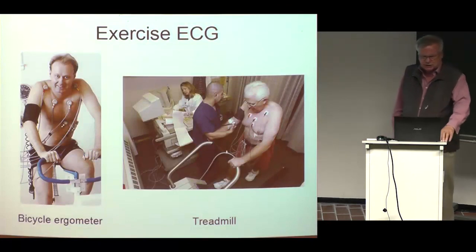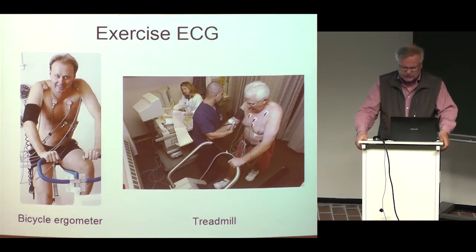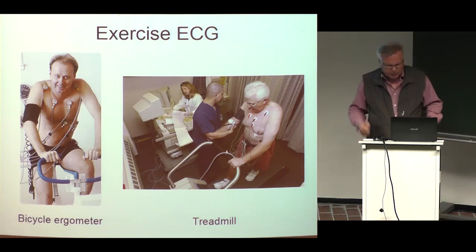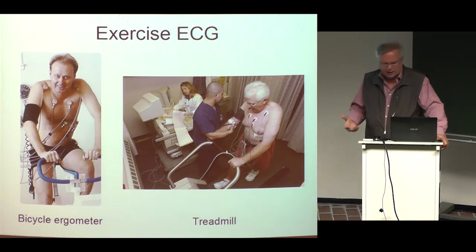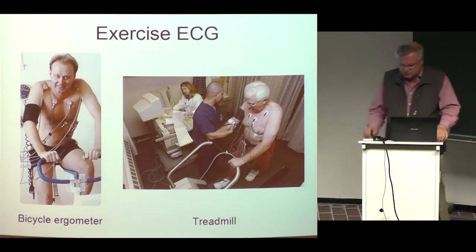In exercise ECG, one certain modification is often or mostly used. What is exercise ECG? Exercise ECG means that it is possible to find out some problems in the heart, diseases, which appear when there is some stress, when the body is exercising, doing mechanical work, and the heart is beating more actively at a higher rate. Then certain cardiac diseases can be diagnosed during the exercise. So exercise is just making some work, and there are two kinds of standard exercises in the world.